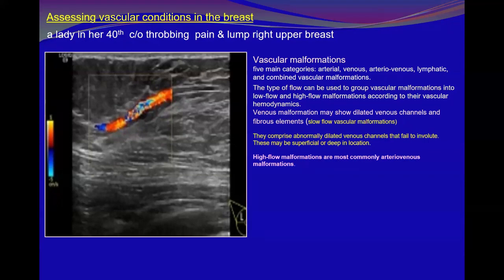As you can see here downward, there is a blue color. Before you proceed, this case I reported a long time ago, and yesterday I asked in the group about how I could identify the velocity from the color. Here you have to estimate the velocity from the color, just an estimation, not clear-cut in figures.